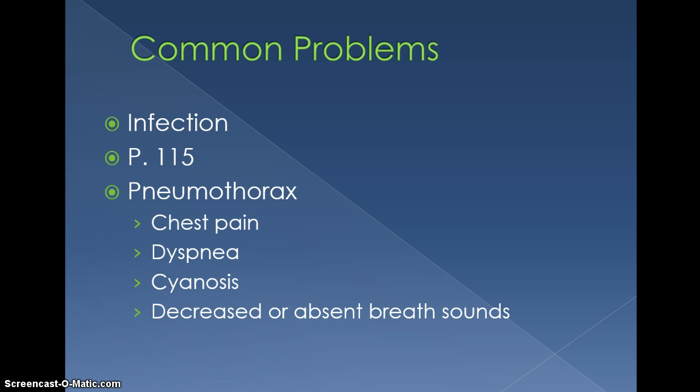If you use serrated hemostats or anything that can eventually cause a tear or a hole in the silicone that's used, or whatever the device is made out of, then you have some problems there. Blood may back up and the fluid may leak. You could have an air embolism if there's a hole. So use anything that's non-serrated. And you're always looking at the catheter to make sure that there are no breaks or cracks that may cause it to have to be replaced.